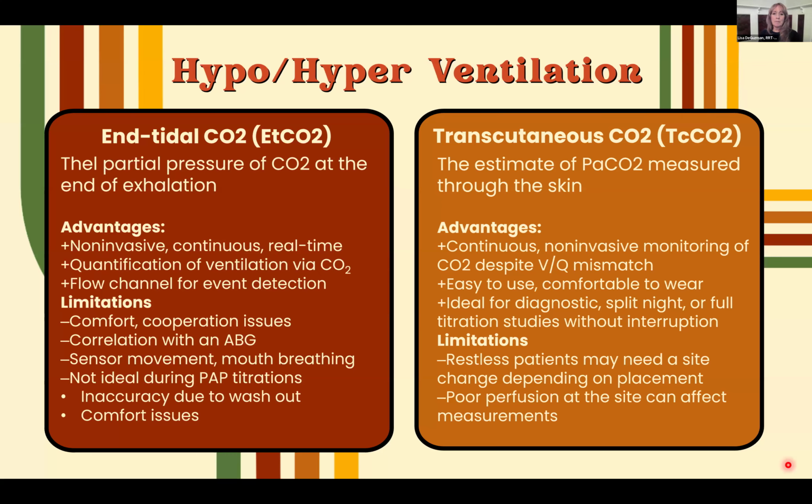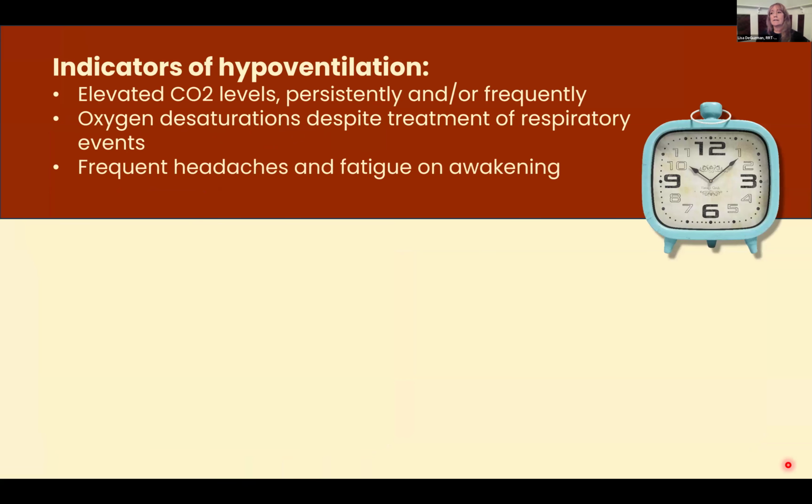End tidal, it's immediate. Whatever's coming out of their breath at that time, it's going to read. It does have a flow channel, so that's an advantage. It's also non-invasive, but not as comfortable. So we have a lot of young and older kids that fight that cannula. So comfort's an issue there. If they position and move around, sometimes that cannula acts with suction, so it can get suctioned down to the skin or the mucus inside the nose, that kind of thing. Mouth breathers, even though we do have the oral drops on the cannulas, don't always pick up well. And then if you have to add CPAP, you're going to wash it out if it's underneath, or it's not going to work at all.